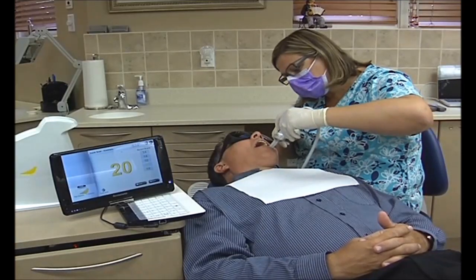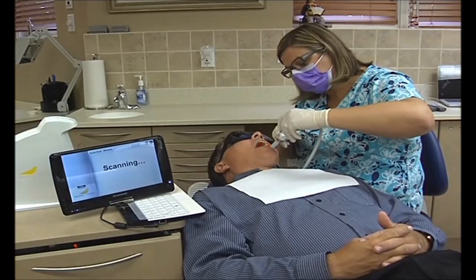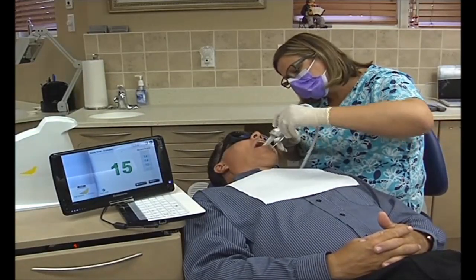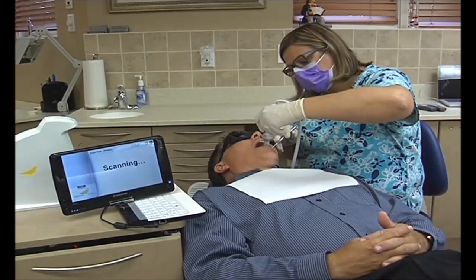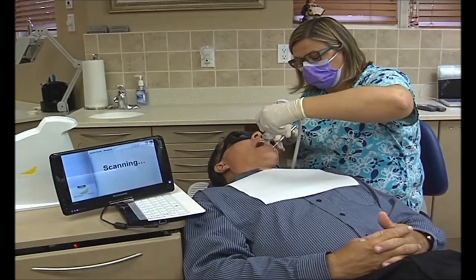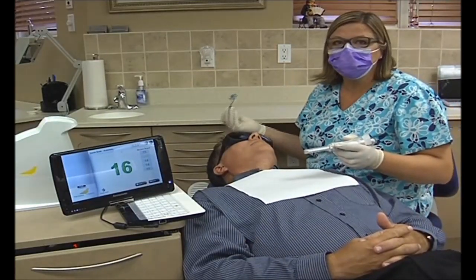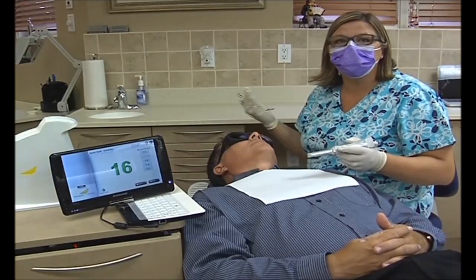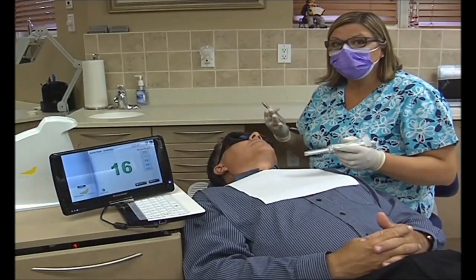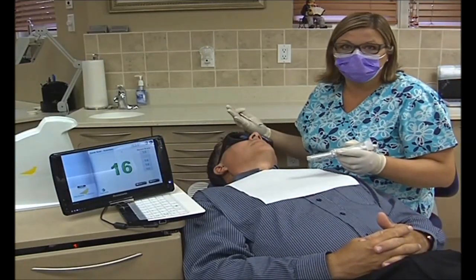I'm just going to check around that whole area. That's a perfect example of where we have some dark shadowing around an old restoration but we're still getting very healthy numbers. So we know there's nothing wrong with that tooth. Before, we would look at it and think there's some decay there — there's gray shadowing around that old restoration. But we know it's very, very healthy. It's just discolored.